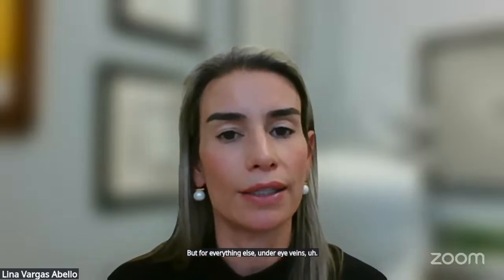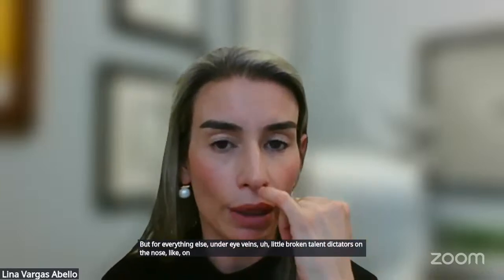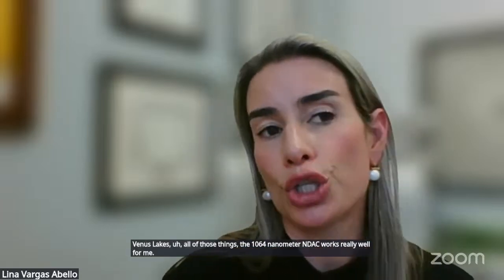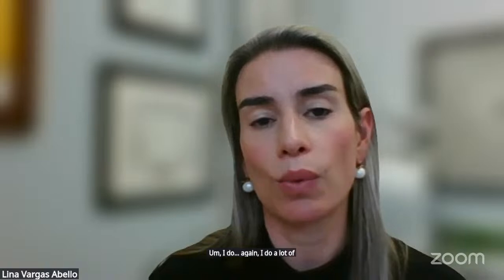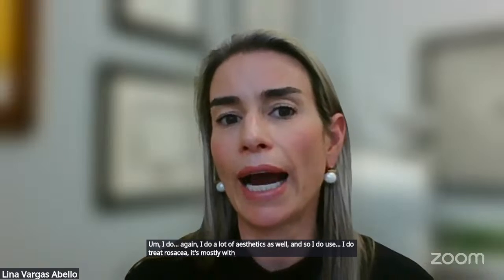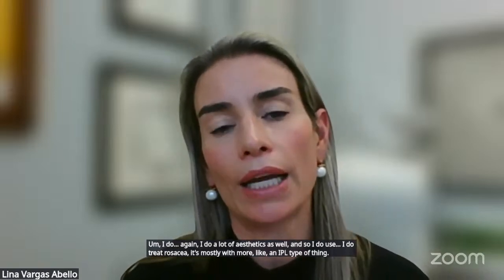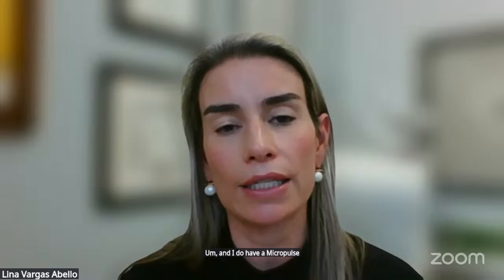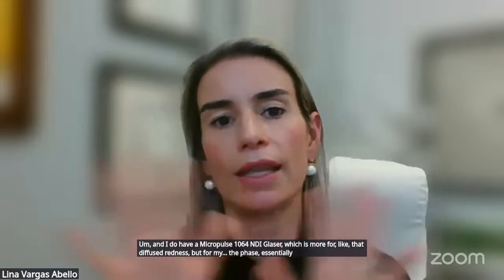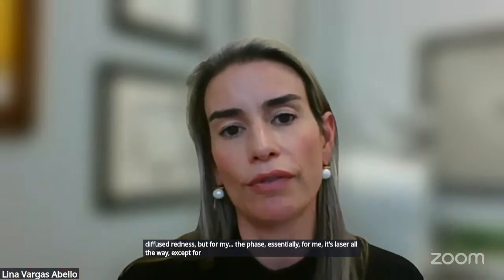But for everything else, under eye veins, little broken telangiectasias on the nose, on the sides below the nares, venous lakes, all of those things, the 1064 nanometer Nd:YAG works really well for me. I do a lot of aesthetics as well, so I do treat rosacea, mostly with an IPL type of thing. And I have a micropulse 1064 Nd:YAG laser, which is more for that diffuse redness. But for the face, for me, it's laser all the way, except for those larger veins, especially on the forehead.